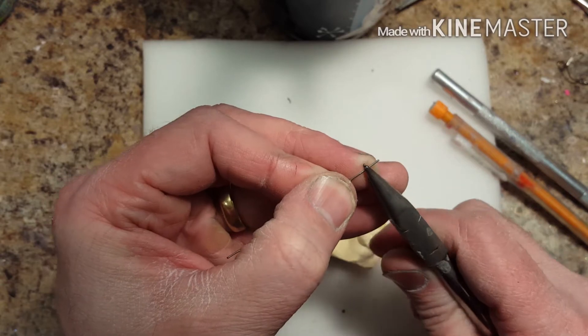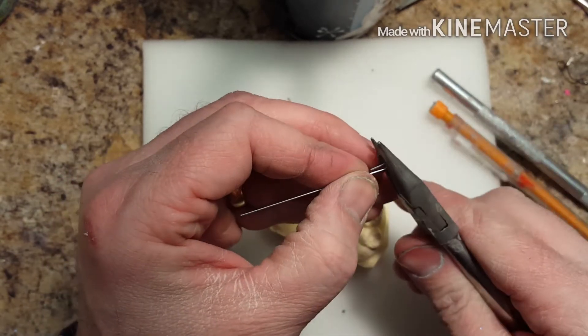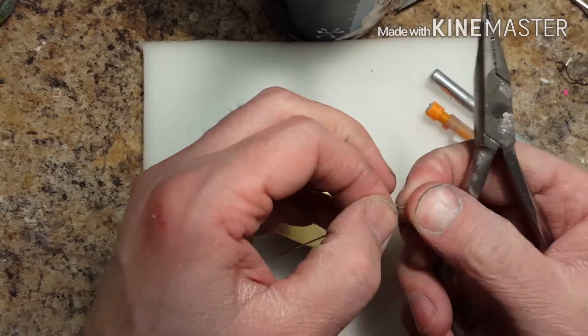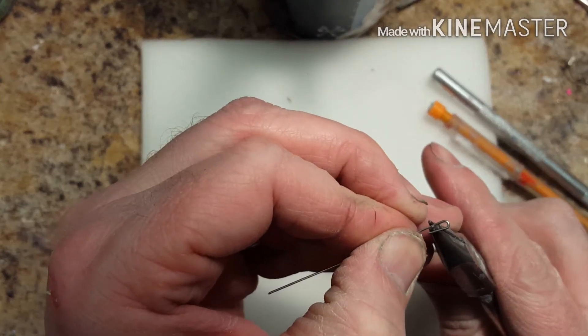I use a bird beak plier — a special bird beak plier that allows me to make really tight, fine bends. I would say this is more of an intermediate to advanced technician skill level. It's not for the beginner.